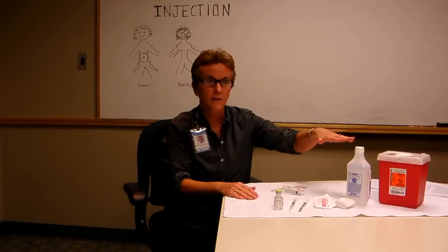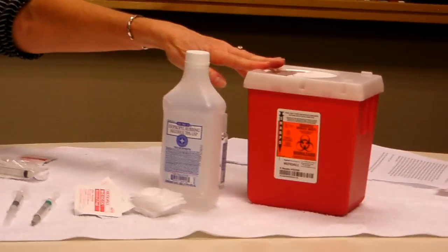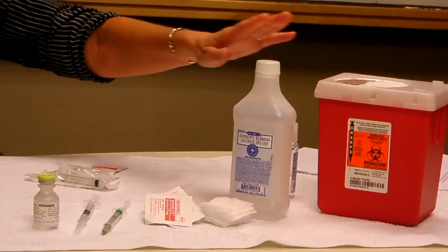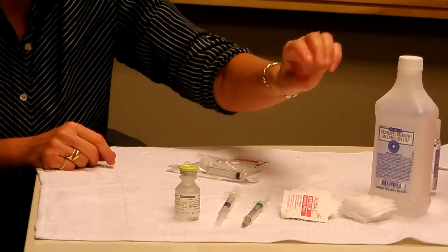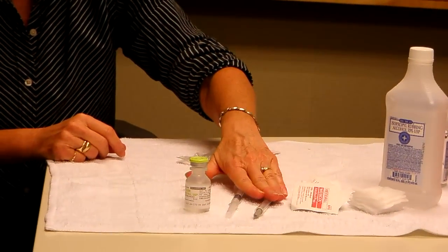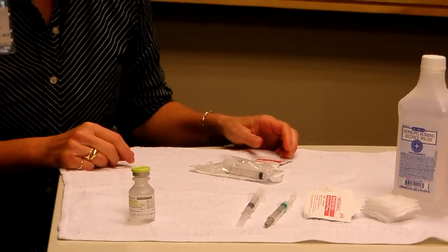The first thing you need to have is everything ready to go. Sharps box for disposal of the needles and syringes. You need an alcohol bottle and some cotton swabs, or you can have some fancy alcohol swabs. Your syringe and needle combination, and of course, last but not least, your medication.